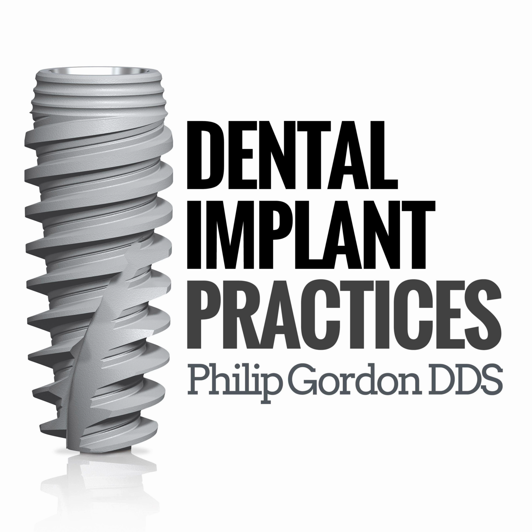So, the surgical kits typically start off with a twist drill, a 1.5 or a 2 millimeter twist drill. And that's just to start the osteotomy. And then there's twist drills that typically have a smaller apex and a larger crestal size. And that's because these implants are tapered. So your drill and osteotomy isn't necessarily straight. It's a tapered osteotomy and a tapered implant.